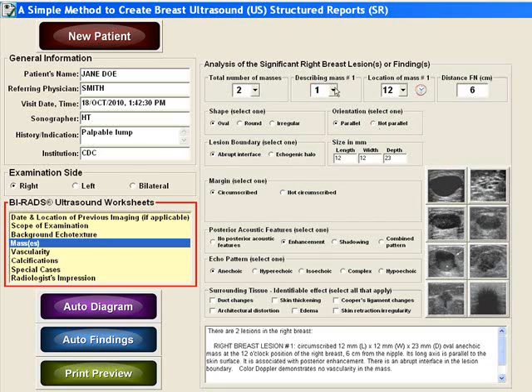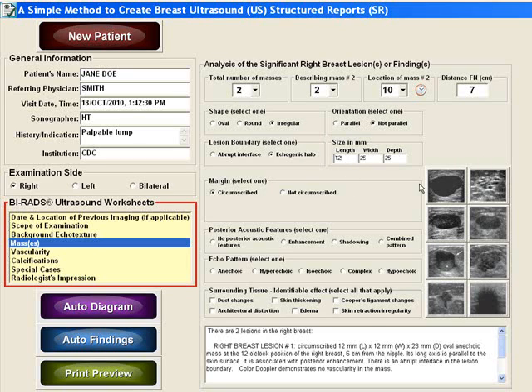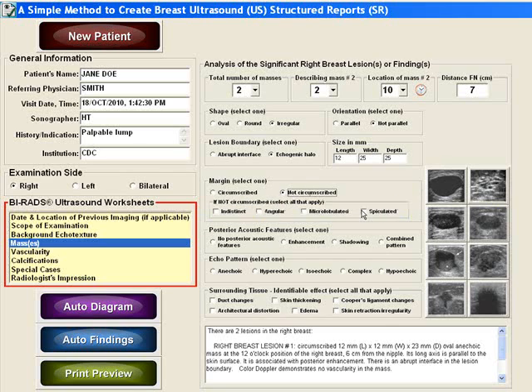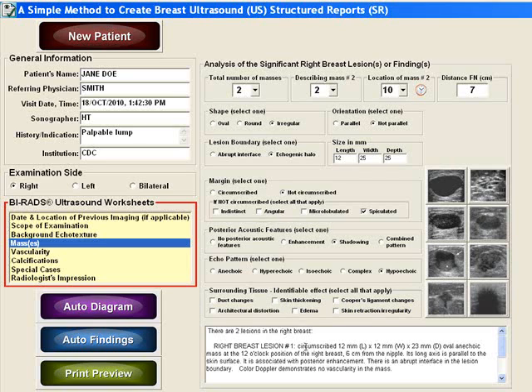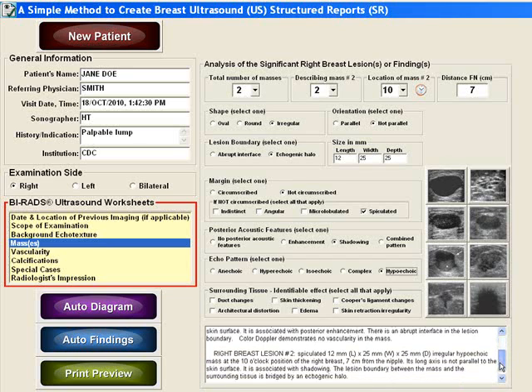Now let's describe the second mass. Let's say that it has an irregular shape, that its orientation is not parallel, and that it has an echogenic halo. We'll enter in the dimensions. Next we'll say that the margin is not circumscribed — let's say that it's spiculated — and that there is shadowing, and that the mass is hypoechoic. There are no surrounding tissue abnormalities to record. Once you've chosen the appropriate descriptors, the structured report will be created in this window. You can review it, and of course you can always edit it if you like.